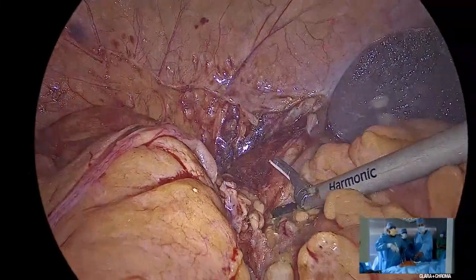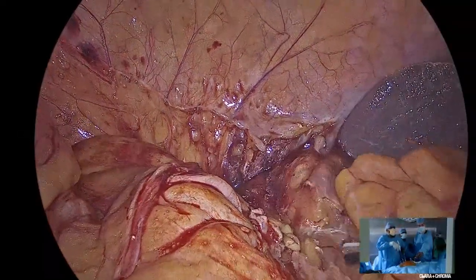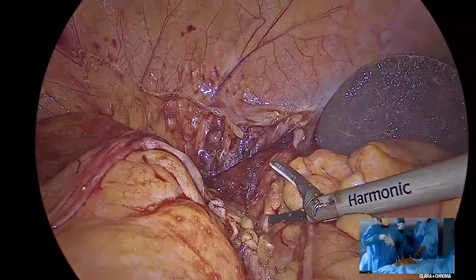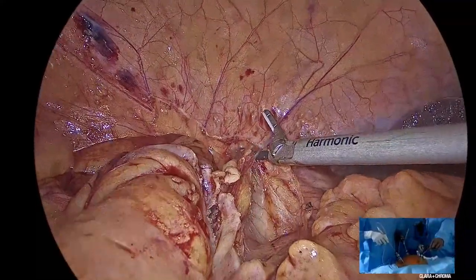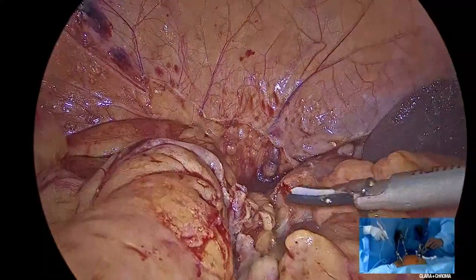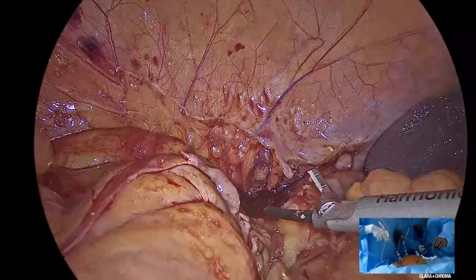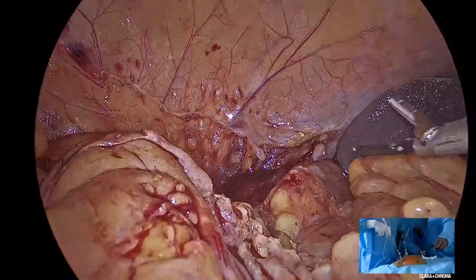Again, we got to be careful. The duodenum will appear. We have already seen it once through the ileocolic window, so we will be seeing it again when we are doing the hepatic flexure. One needs to be conscious of that all the time. I am mentally prepared to see the duodenum in a slightly atypical position here because this chap has had a previous ulcer surgery. So I've seen it from the inferior window. How it's going to appear at this level, I don't know.